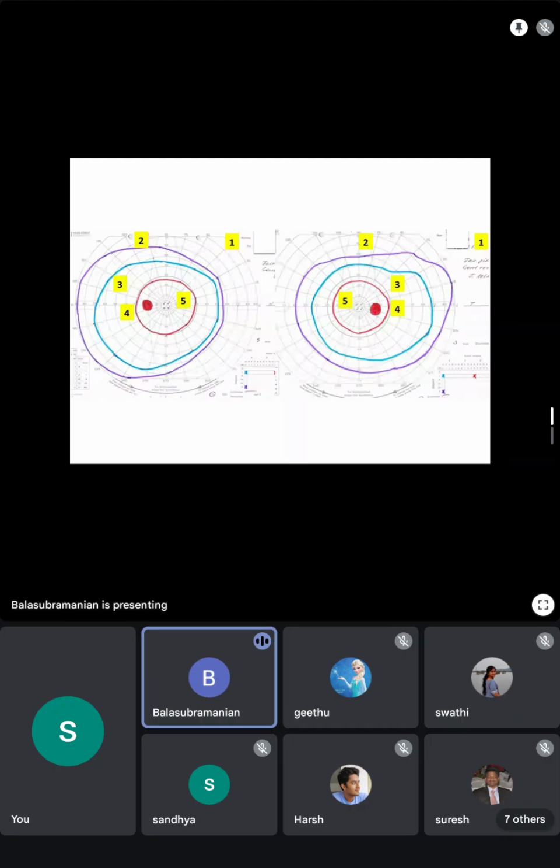It is the term used for kinetic perimetry, where the lines show isopters connecting points of equal sensitivity. Interpretation of the Goldmann perimeter is a totally different and big topic in itself. We are not doing this regularly, but we used to do the tangent screen method. I just want to give an idea that isopters are not used in static perimetry, but in kinetic perimetry. Okay.